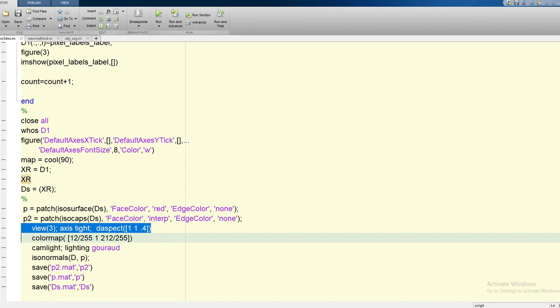Thereafter I move toward the second part of the algorithm. Let us run the program and see how it runs and how we would be able to see the outcomes.